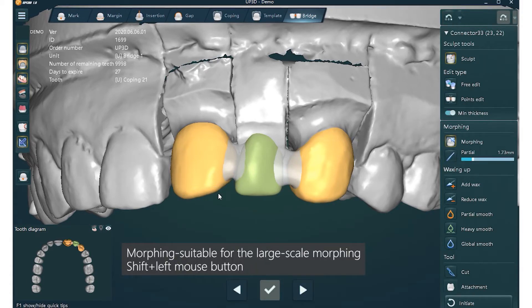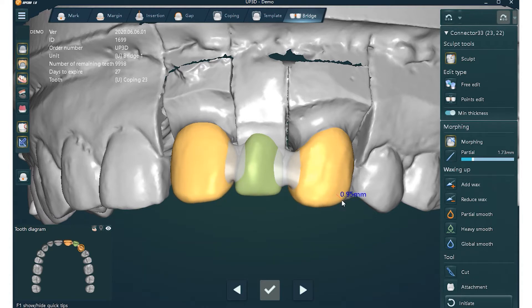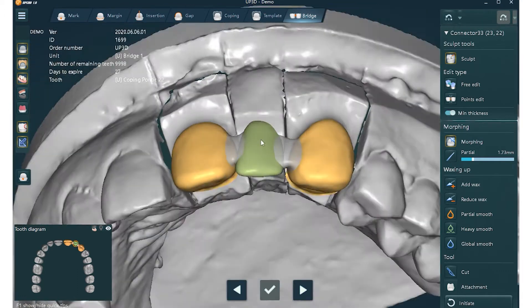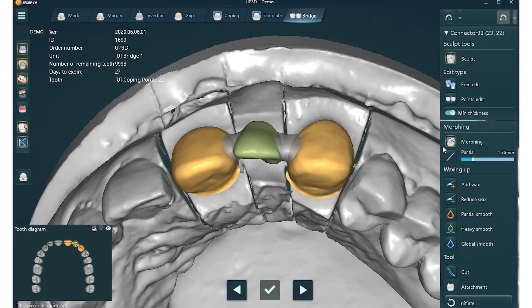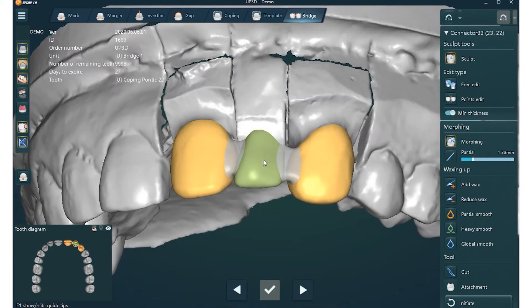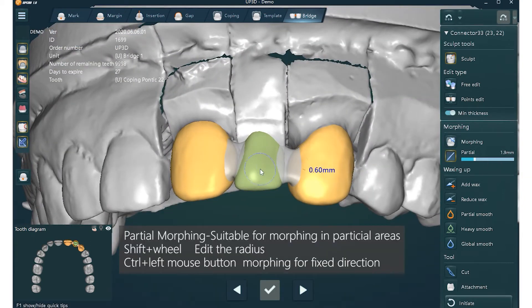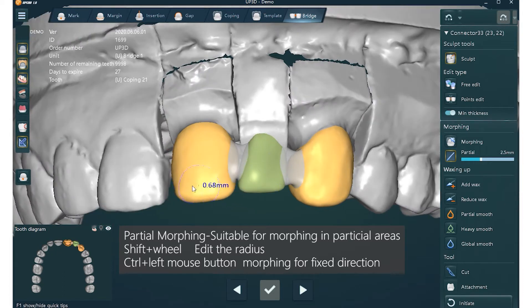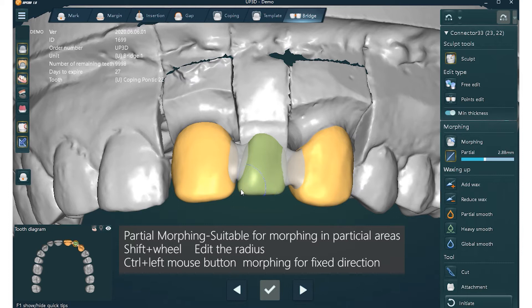Morphing. Suitable for the large scale morphing — use Shift and left mouse button. Partial morphing is suitable for morphing in partial areas. Use Shift and wheel to edit the radius. Use Ctrl and left mouse button for morphing in a fixed direction.